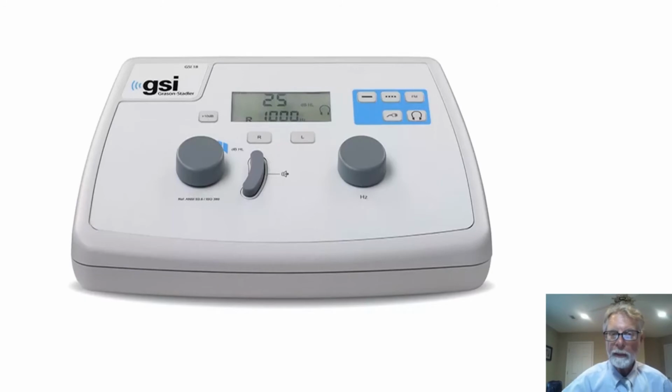Here's the front panel of a typical audiometer. This may be the model that you have, or you might have a different make and model, but they all have things in common. The knob that you see here on the left is the intensity knob. It's how we control the intensity, the dB level of the stimulus.